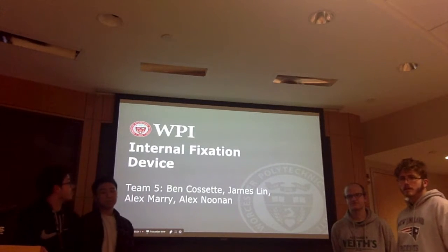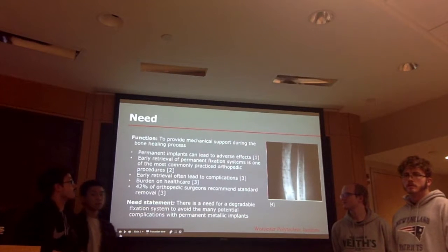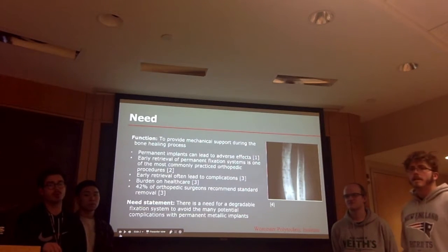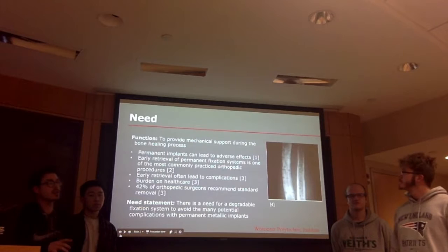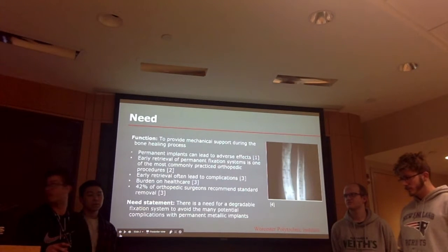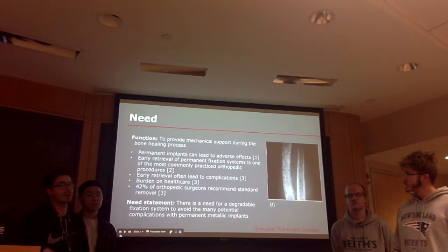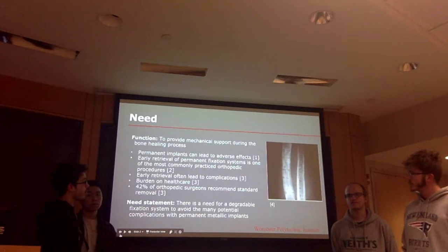Alright, we're Team 5 and we're proposing an internal fixation device. Internal fixation systems are used to provide mechanical support during the bone healing process. Currently, most of these implants are made out of non-biodegradable metals and they're designed to remain in the patient for life. This can lead to a variety of adverse effects such as patient pain and bone loss due to stress shielding, of which you can see an example on the right.